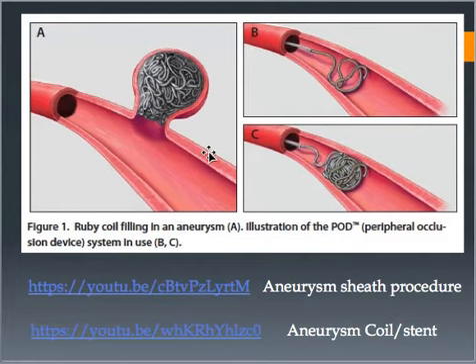So this is what it looks like. This would be what an aneurysm kind of looks like from the inside. You've got the artery here, and then there's this big outpouching here. What's inside there right now is the coils, when I talked about coiling. So you can go in and you can coil off this aneurysm so that the blood will not flow into it. It'll just bypass it. And you can also do the same thing in an artery as well. I have a couple different videos here that I'll show you. Let me pull these up.